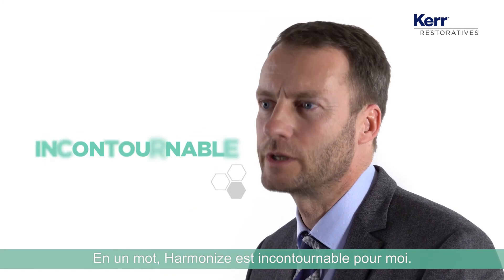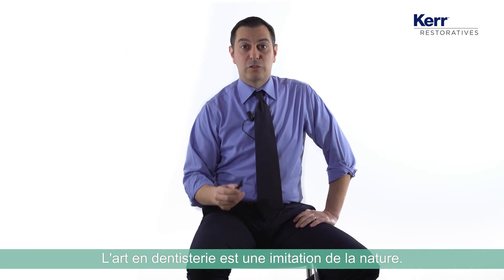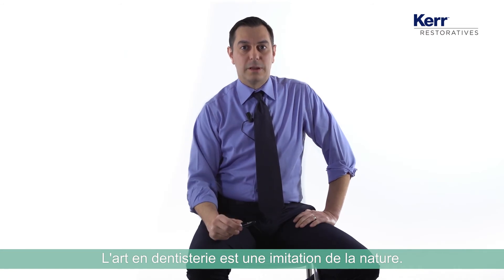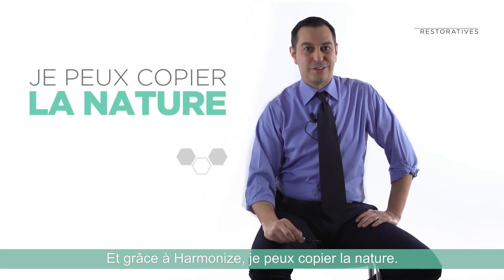Harmonize for me, in one word, it's a must have. Great restoration in a simplified way. Artistry in dentistry is to copy nature — and thanks to Harmonize, I can copy nature.